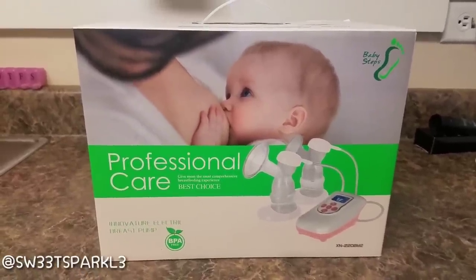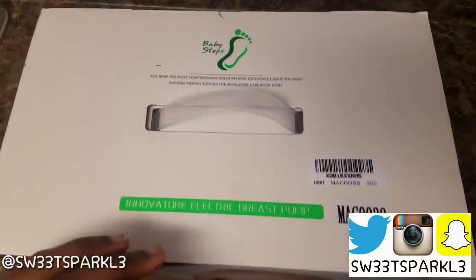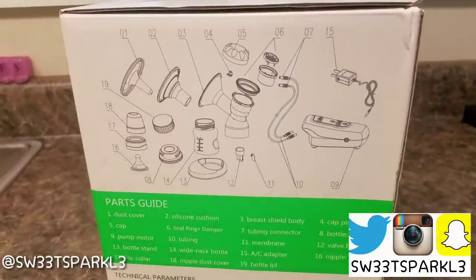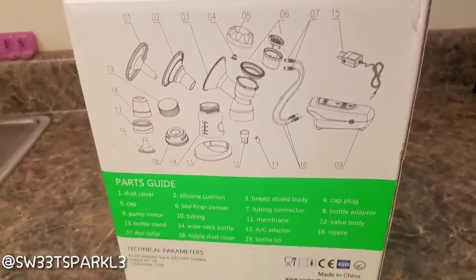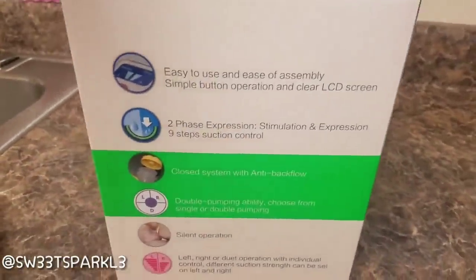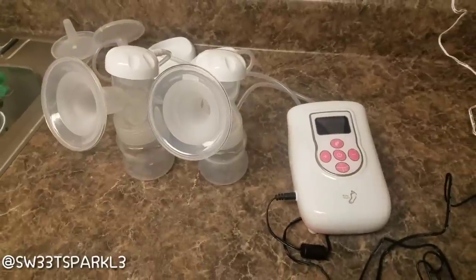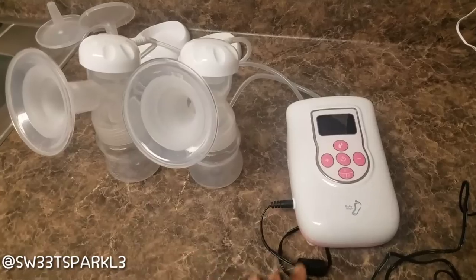Hey everyone, today I'm going to be doing a first impressions review of this breast pump that I was sent for my personal review. This is Baby Steps — that's the brand — and it's an electric double breast pump. On the side right here are all the parts and pieces it comes with. This is the back of the packaging, and the other side shows some of the features that the pump has.